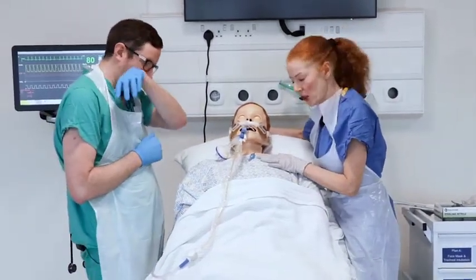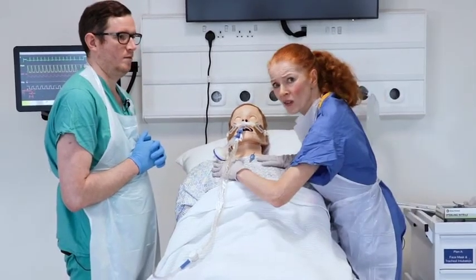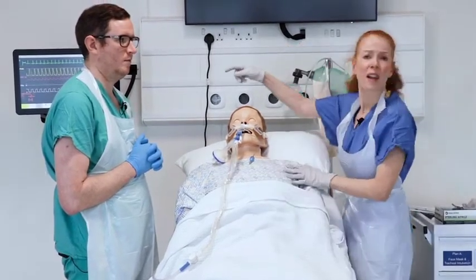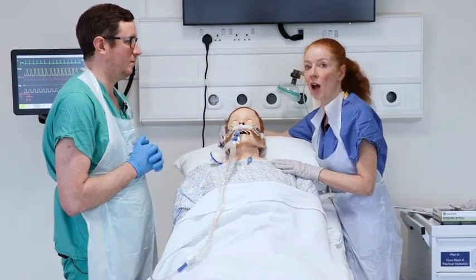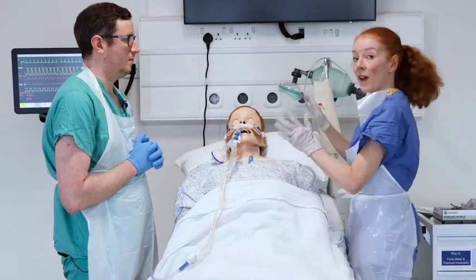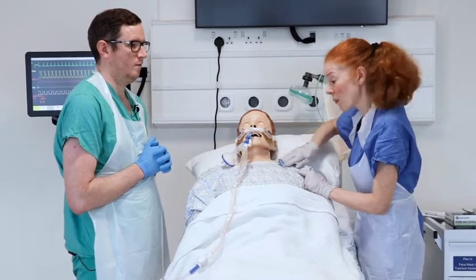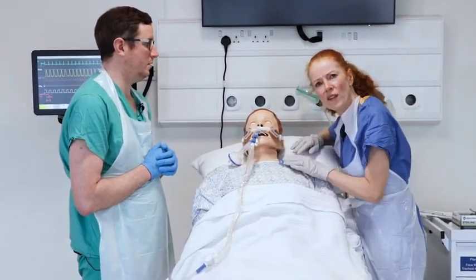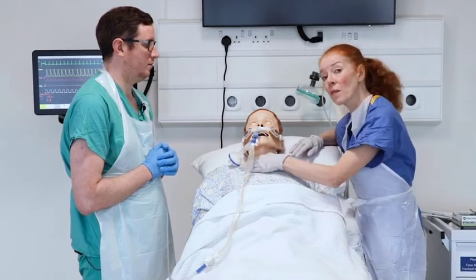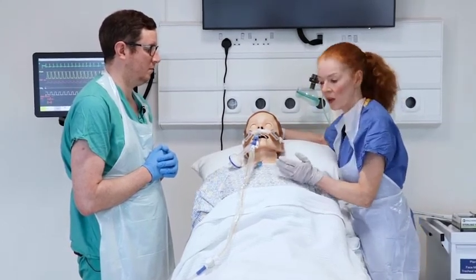I have assessed my patient: he has started to cough, I can feel secretions on his chest, and the alarm from the ventilator is a high pressure alarm. If time allows, I will use a stethoscope to listen to the patient's lungs to check for wheeze or secretions. If it confirms upper airway secretions, I will proceed to suction.